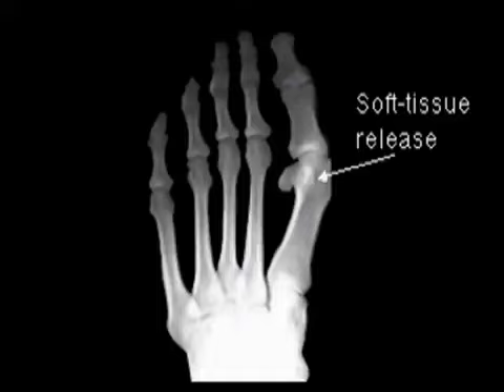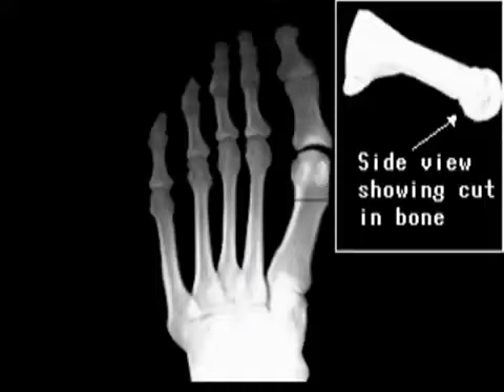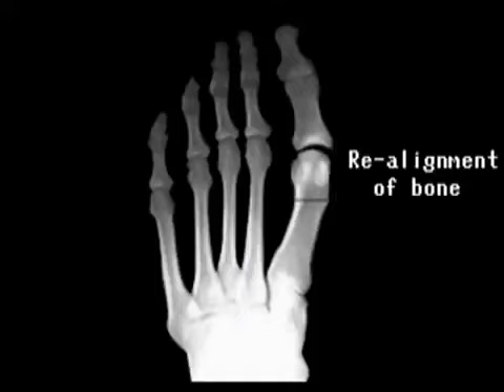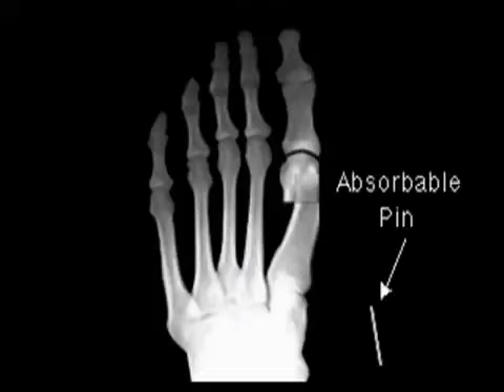Soft tissue release allows for proper repositioning of the sesamoid bones. A cut is made in the first metatarsal head to allow for proper realignment of the metatarsal bone. The overhanging ledge of bone is removed and fixation accomplished using the surgeon's choice of fixation devices.